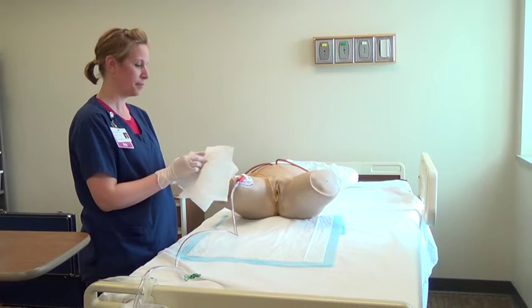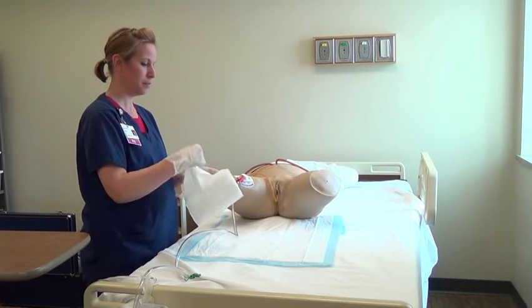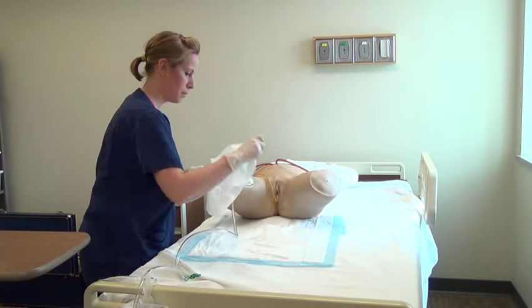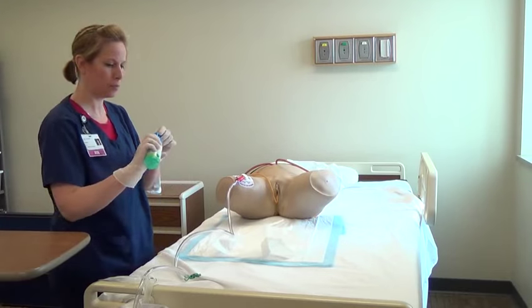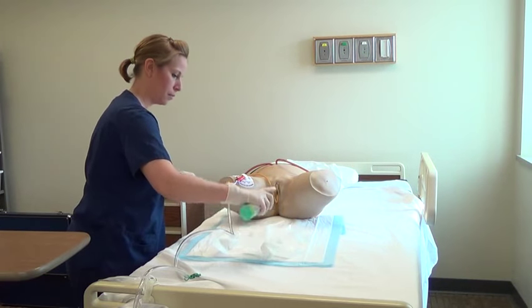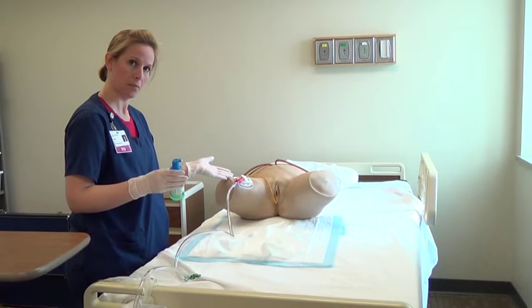Have the patient open up their legs. Take 5 disposable wipes and place them on the pad between the patient's legs. Dispense 1 pump of foaming cleanser on each of the 5 wipes. As a note, the Foley catheter can remain secured to the patient throughout this procedure.